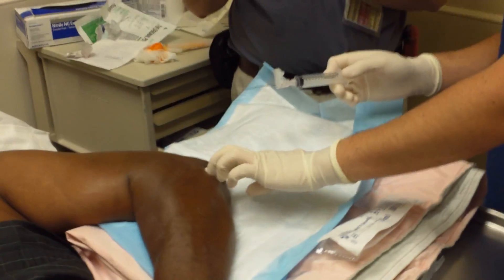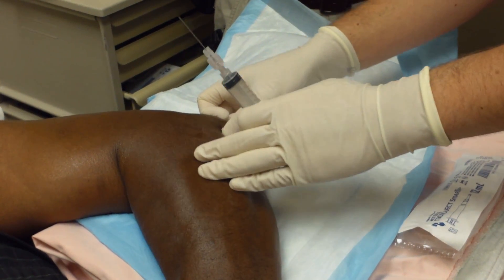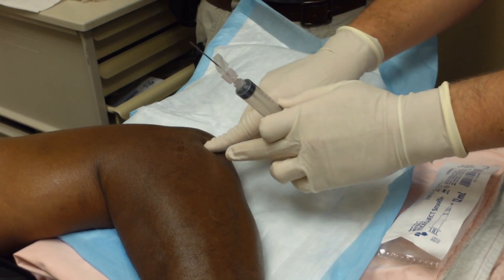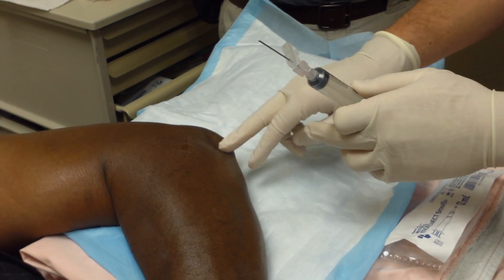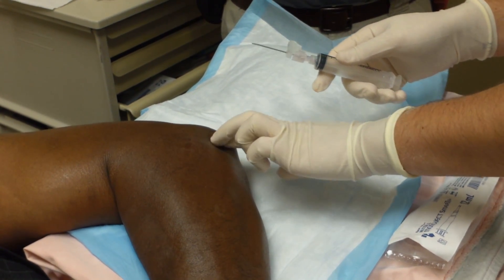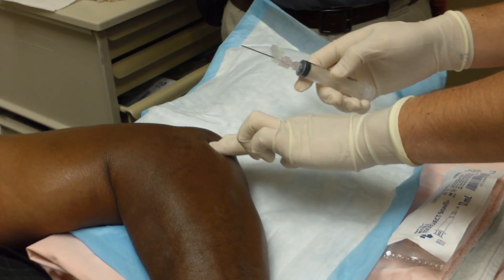Eric, do you want to tell us what you're doing? Sure. So I'm going to tap this elbow — I'm looking for crystals; this is a suspected gout patient. The landmark I'm using is the lateral epicondyle of the humerus, and I'm trying to come right between the ulnar and the radial bone. They form a triangle right here, so I'm threading right between those three bones. The patient is flexed at 90 degrees with the arm pronated.